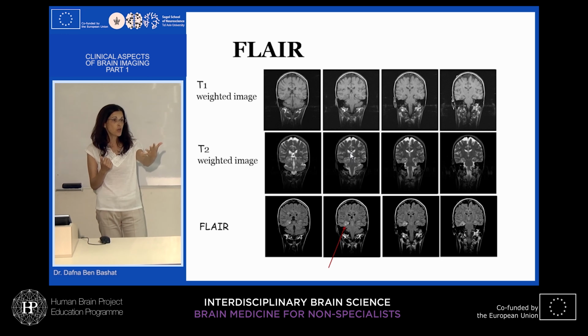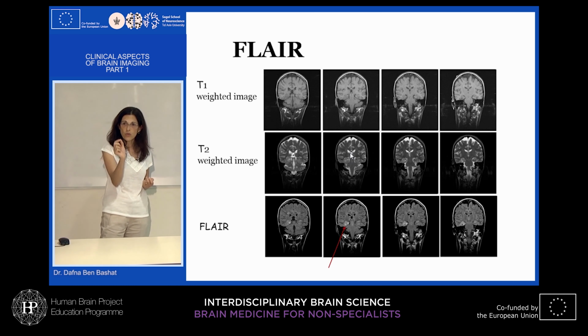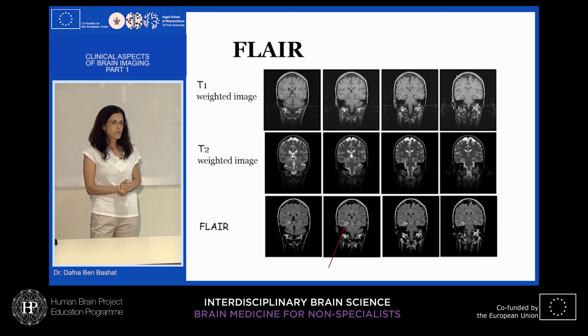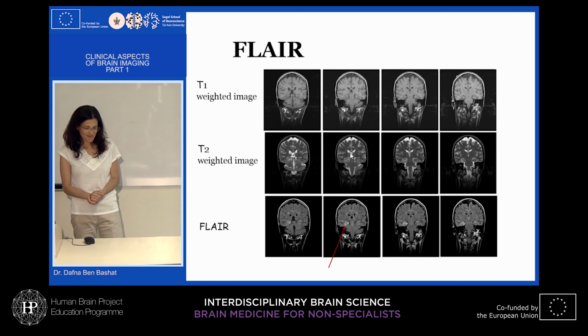If it's longitudinal, you have two images, do registration and comparison, and mark for the radiologist that this area was changing. But nothing is really implemented in routine beside what I saw in breast imaging. It's not there yet.